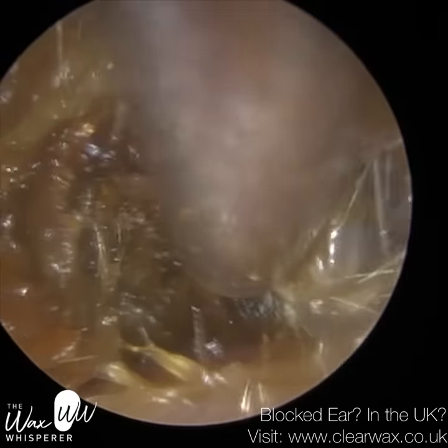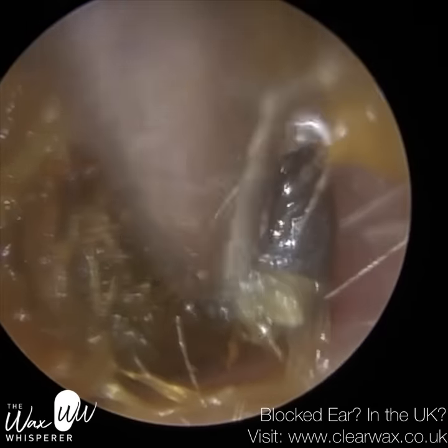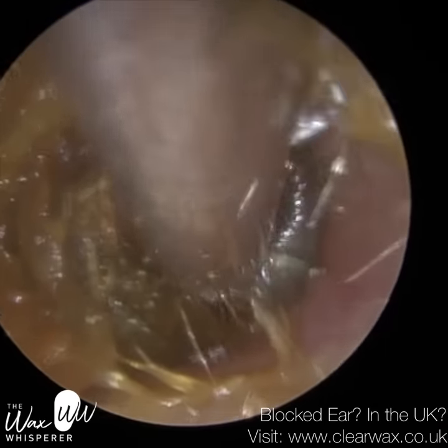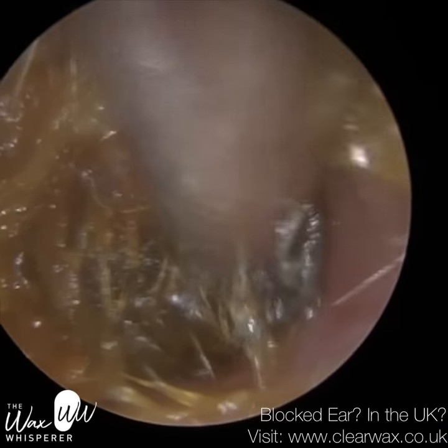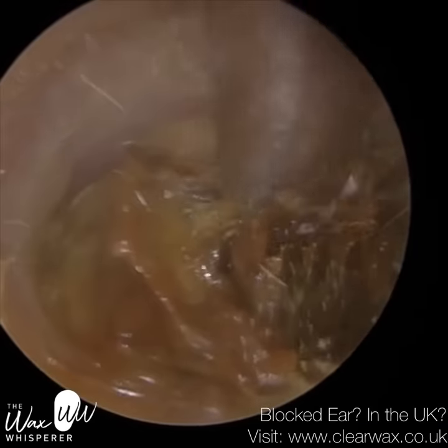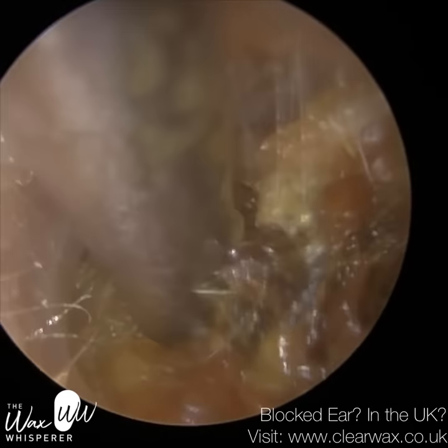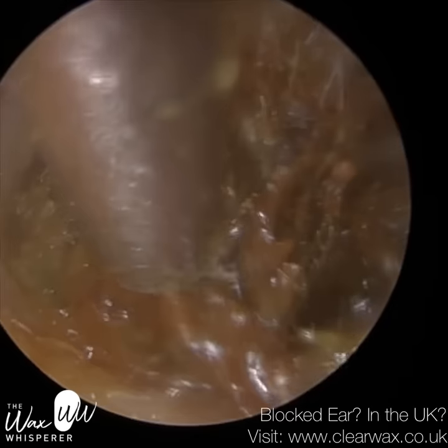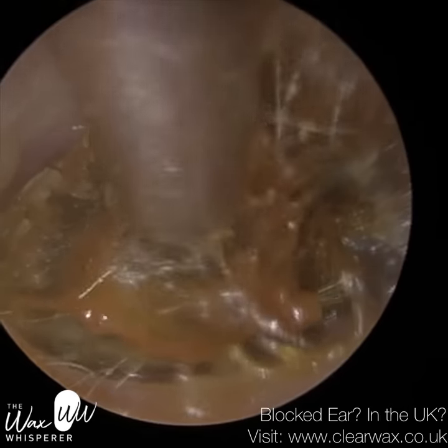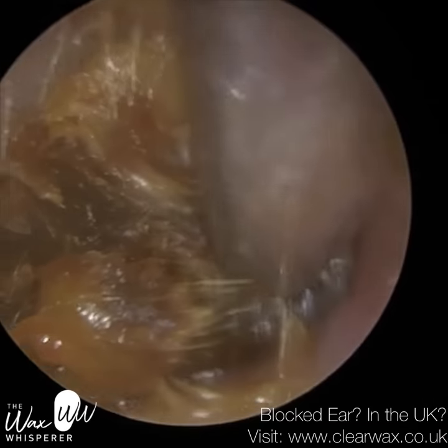Now, around the periphery of this wax plug, you've got a thick layer of skin that's semi-shedded, I would say. So part of it's still attached to the ear canal. It's very adhesive, sticky. The oil I've just instilled helps with that. It almost helps to break down that adhesiveness. And I'm just trying to separate this plug around the edge of the canal wall first.